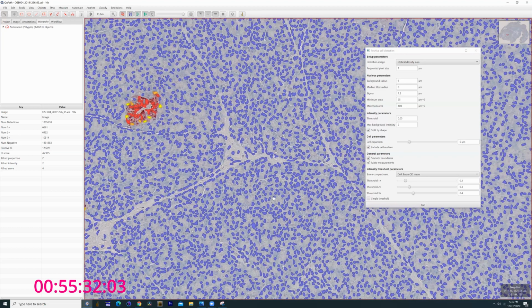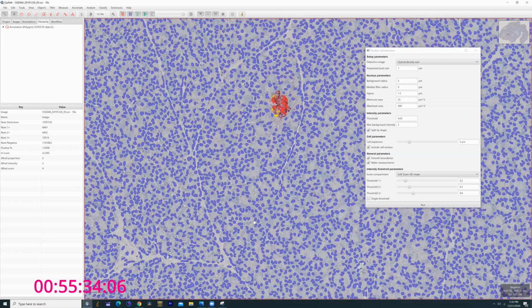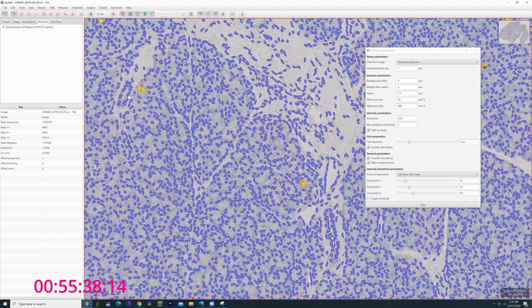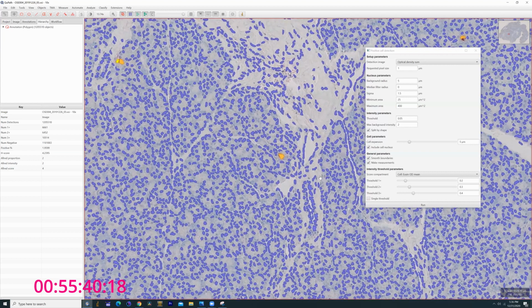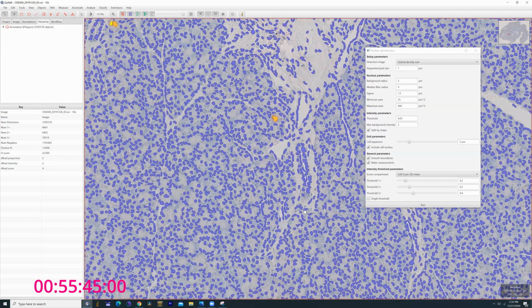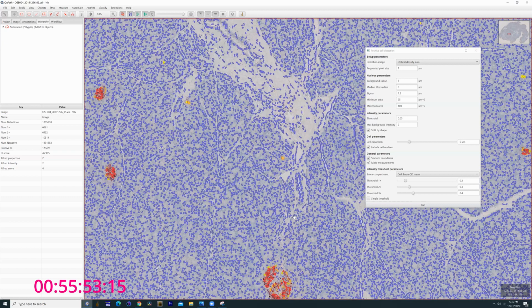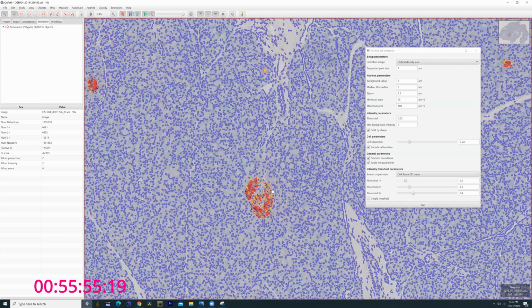And you can see in the connective tissue, it's actually not quite so bad. You can see that it's highlighting things it thinks might be cells. There's a connective tissue running through. It looks like it missed some of these low level ones. I don't know what this is actually, to be honest. And again, this is partially a problem with the sections as well.